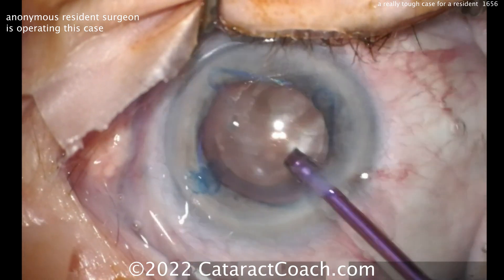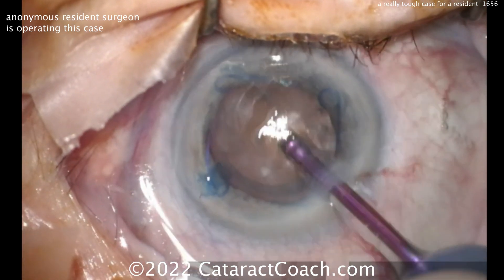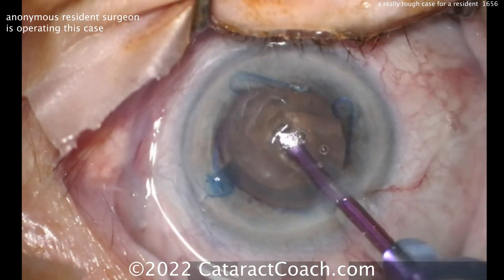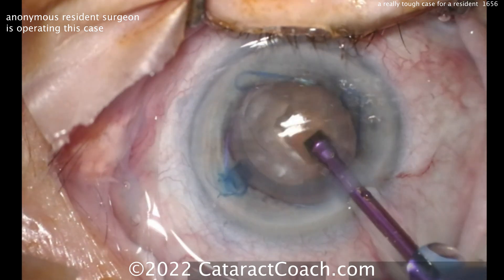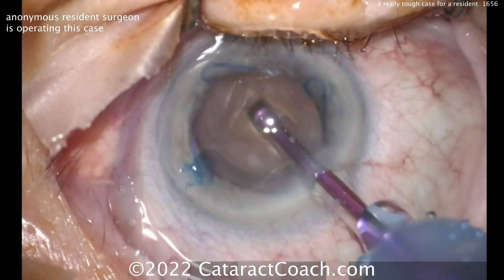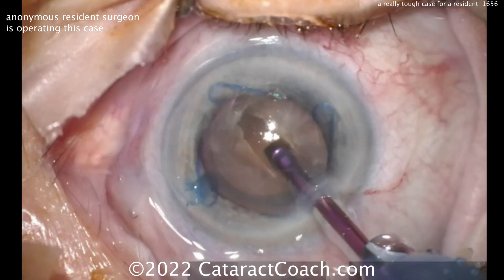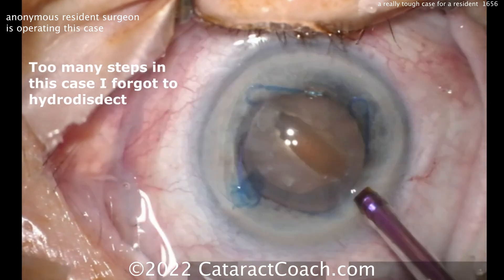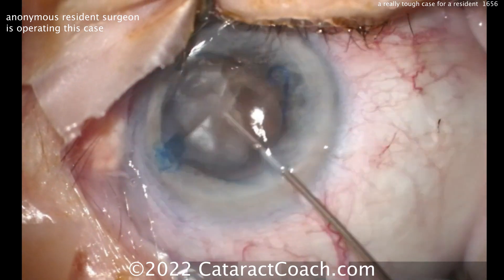What about hydrodissection? Okay, groove down the middle — hydrodissection would have made life a lot easier. Also, draping the lashes would have made life a lot better too. See those lashes in the field? How do you spell endophthalmitis? How do you spell staph and strep? That's where it's coming from, right there. Yes, you did forget the hydrodissection — you can still do it now. That's not a bad idea. I like that — good move.